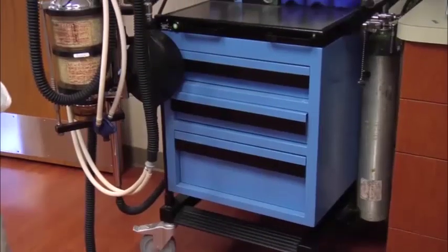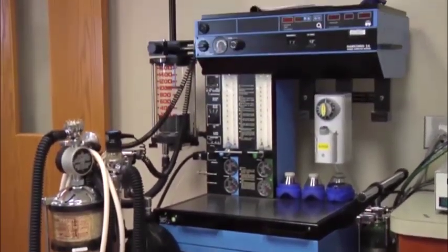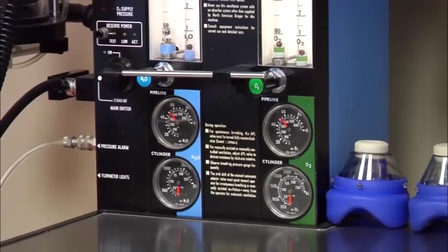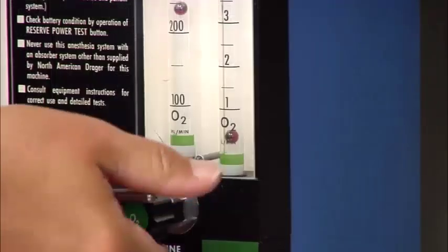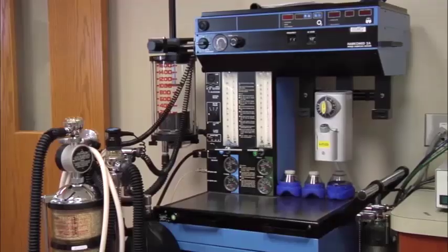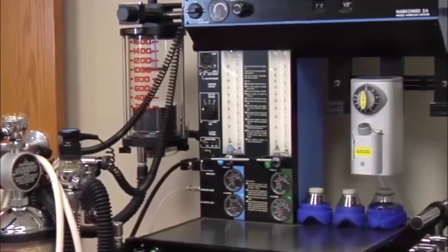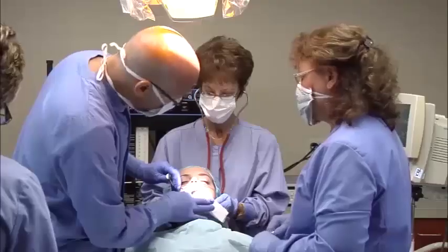There are many types of machines available to assist in the delivery of anesthesia. Some provide nitrous oxide, others potent inhalation agents. The one true requirement is the ability of the equipment to deliver oxygen at a concentration of 100% with positive pressure in the case of an emergency. All anesthesia machines must be checked and calibrated on a regular basis as mandated by your state and in conformance with the manufacturer's recommendations. The most important monitor is the anesthesia team.